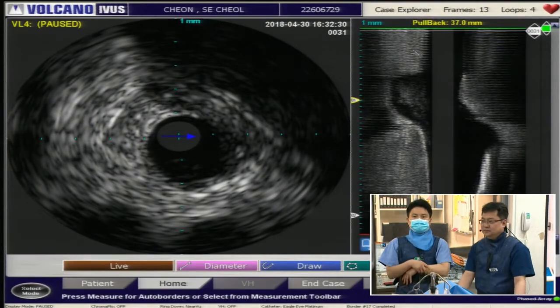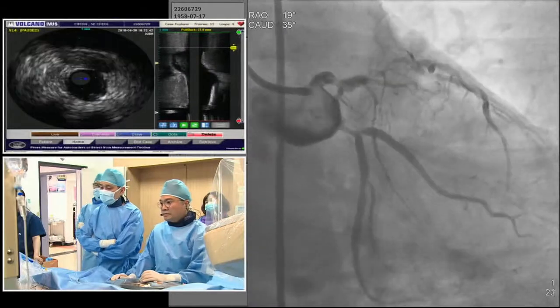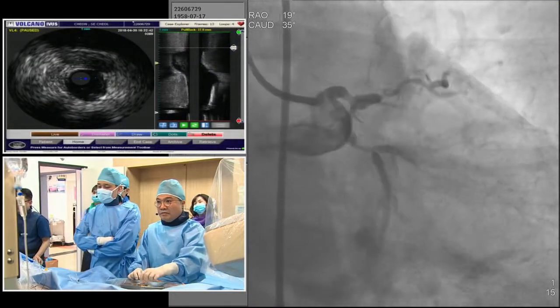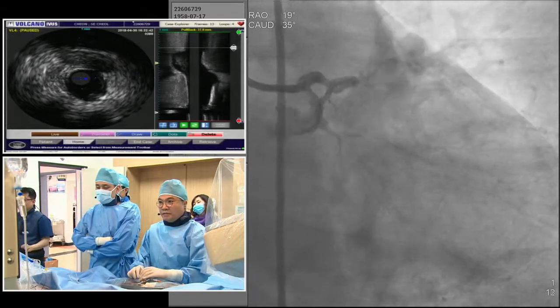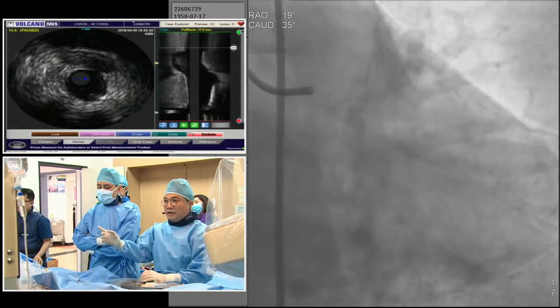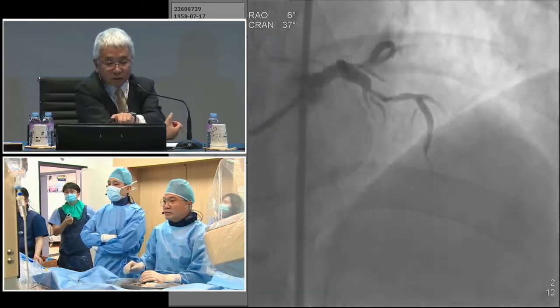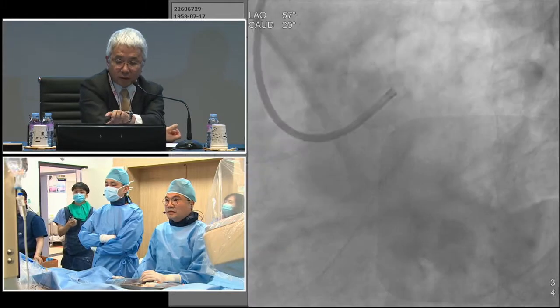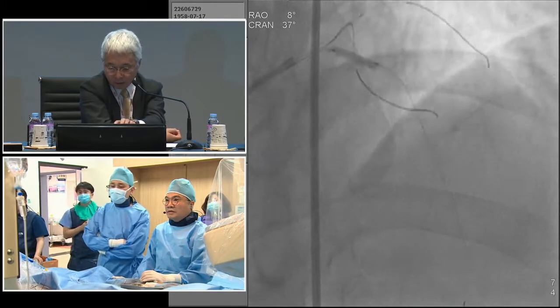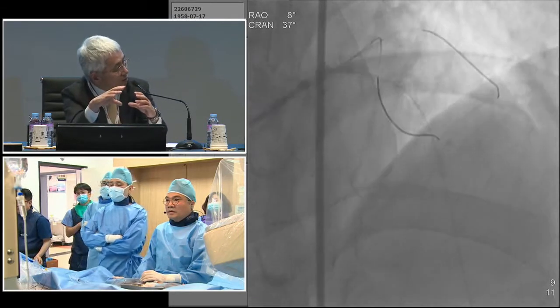So I invite the panelists' opinion. And Dr. Hikiji, I'd really like to get some comment on how we can make a PCI strategy for the left main bifurcation area. Actually, this LAD region is exceptionally very long, especially the distal part of the LAD, the size is not so big, and the proximal part, especially left main, is 4.5. So many diameter discrepancies remain.